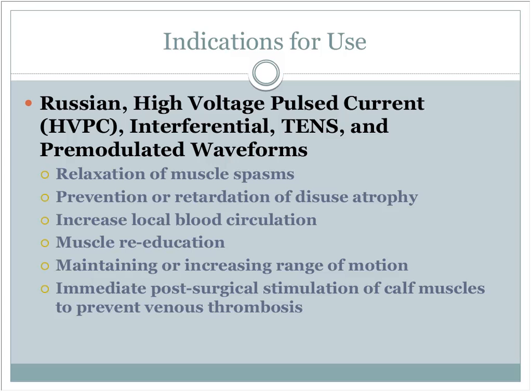Is it the correct waveform? Are you doing it for somebody to work on muscle reeducation post-stroke, and do you need to try a different waveform to make that happen? So keep all that in mind, and that way you have a relative idea of, I shouldn't have to turn it up this high to get the desired effect. Why am I cranking this up so high? Am I going to do damage to this patient? Is it a bad lead on your electrode? Because that can happen, and you don't want that suddenly to kick in, and now you're delivering this overwhelming stimulation to this patient.